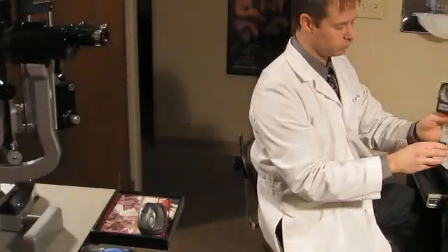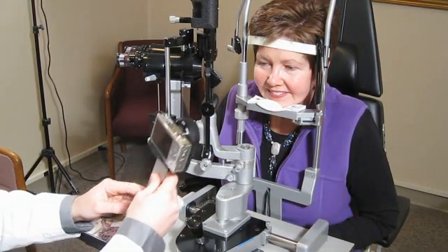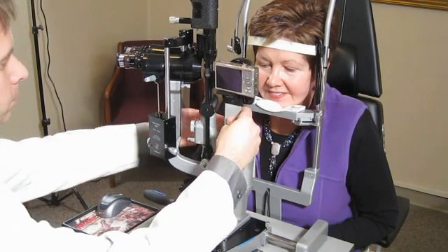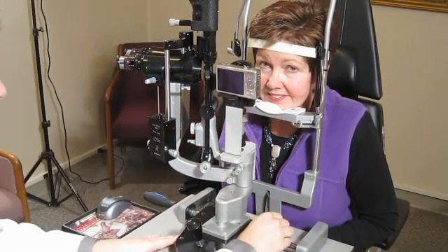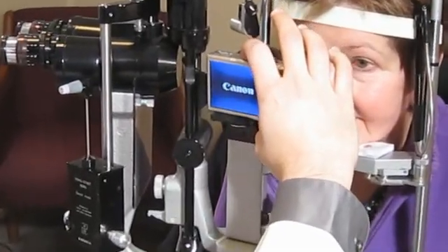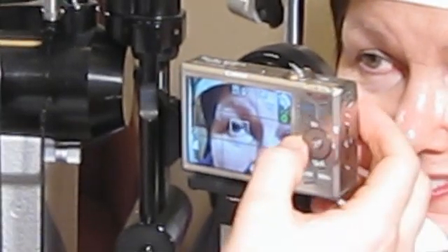The camera light system is attached by moving the slit lamp oculars and slit beam arm to the left. Remove the cover plate and simply insert the spindle into the central column. The camera is turned on, the flash turned off, and the macro mode is engaged for all of the photography.